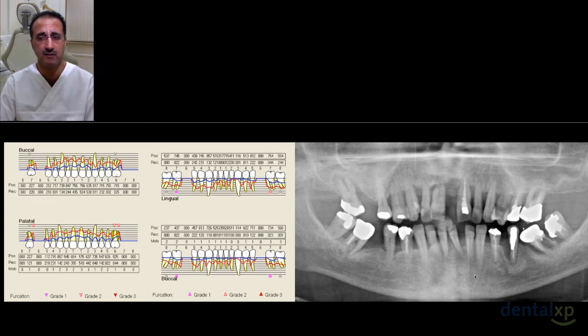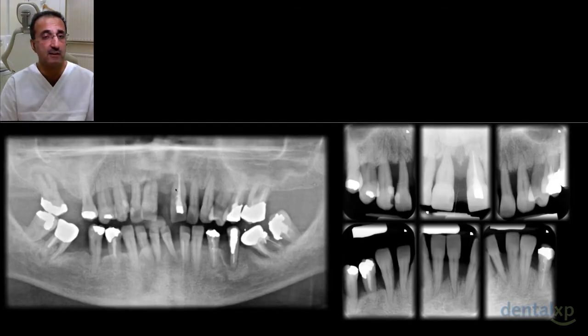We look at the radiographic picture, and you can see that there is very little clinical attachment and bone left on many of the teeth, and clearly things are bad. If we just extract the teeth, however, because the teeth are splayed and forwards, the bone is no longer in the right place. So we would need then to flatten the ridges to place our implants, and this would then mean perhaps biomechanically and phonetically, and finally from a hygiene point of view, that the design of the prosthesis is rather less easy to maintain.